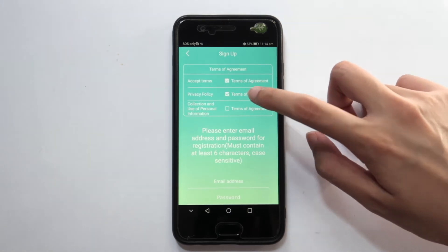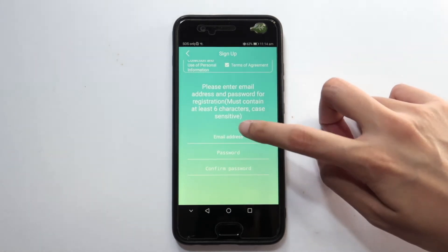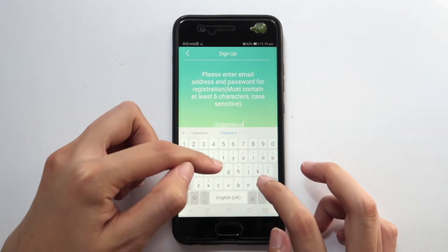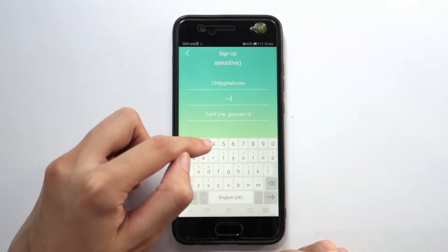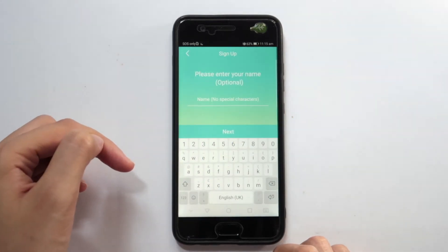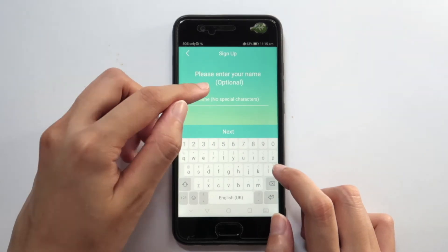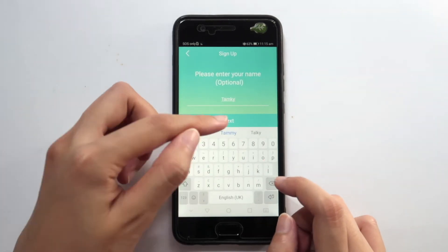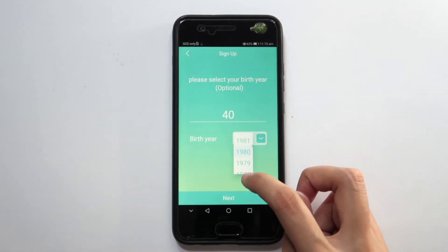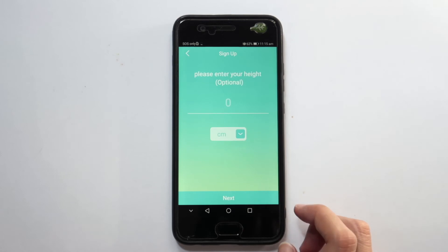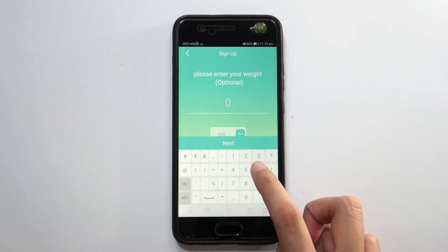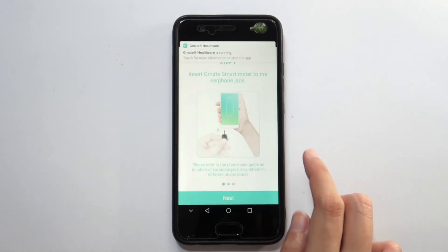Click all the Terms of Agreement and fill in your preferred email address and also your password. It can be any password as long as you can remember it. Now, fill in your name, age, height, and weight. Once completed, click OK.